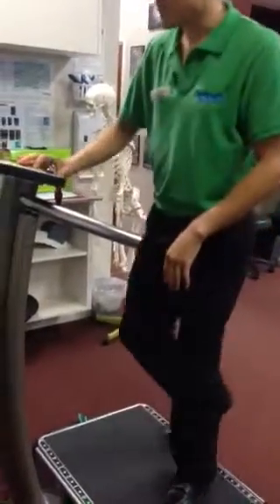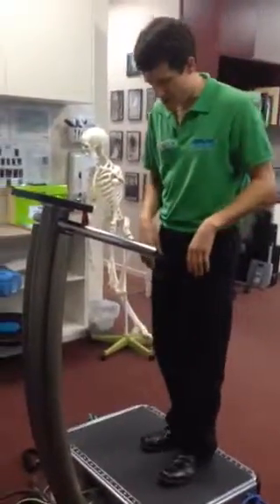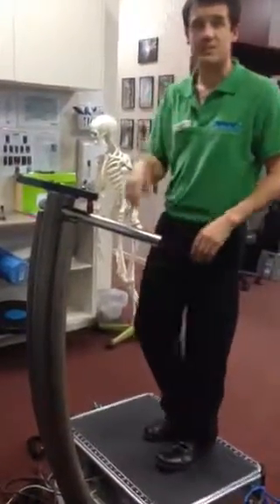I'll just hit start here. The machine works by the plate vibrating, and the vibrations help with the tendon healing process.